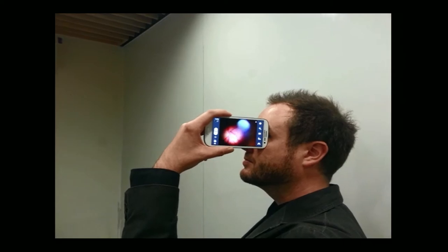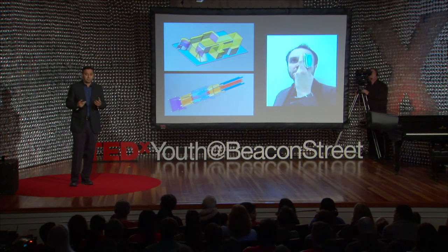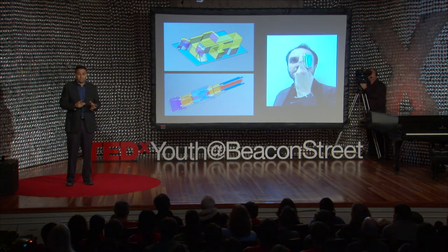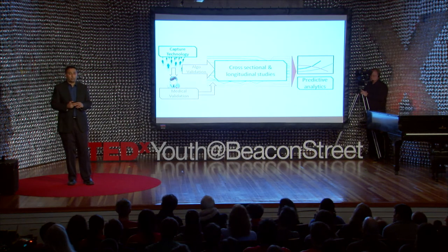Isn't that interesting? So what are we going to do when we have solutions like this? Of course, years of research in my team has gone into building solutions like that. So my student Everett Lawson is actually just hiding what's behind the phone, because there's a lot of electronics and optics and waveguides and new types of computational photography that allows us to convert phones into something that allows us to scan the retina. So what does it mean when we can create such portable solutions and start deploying them?